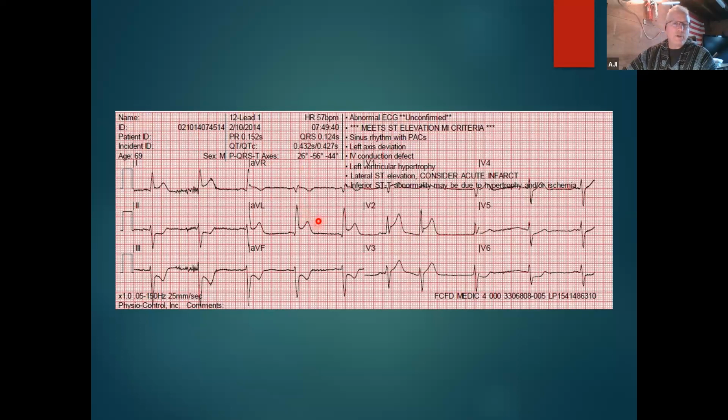When the hospital gets this, they're able to take the name up here and pull an old chart and an old EKG, and also pull the history and meds and everything else that goes with this chart, to assist them in treating this patient and getting them the treatments they need in a timely manner.